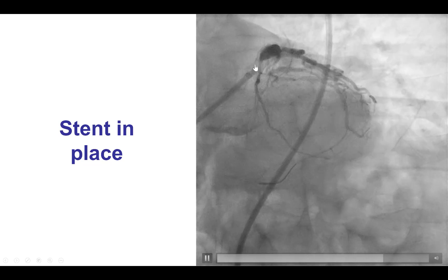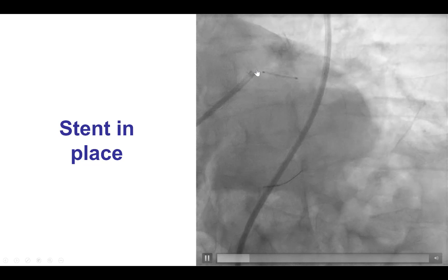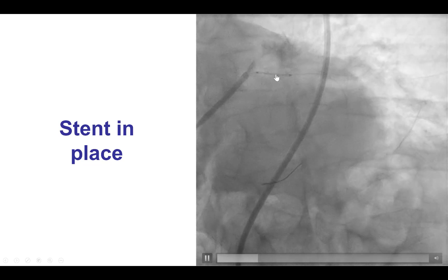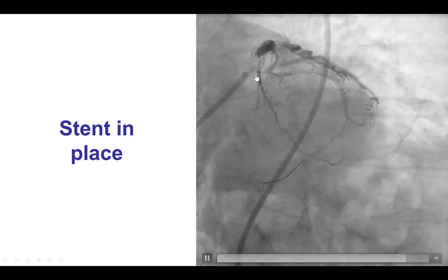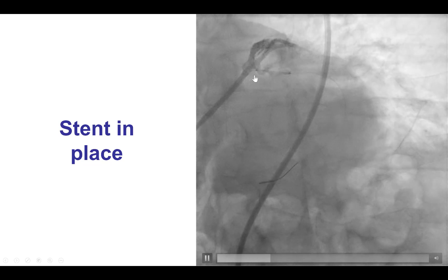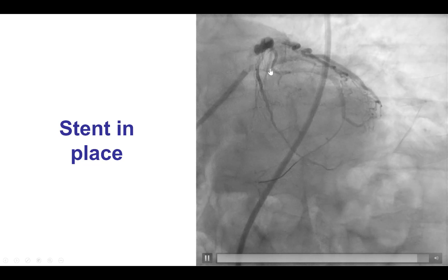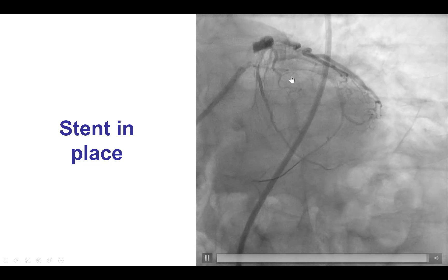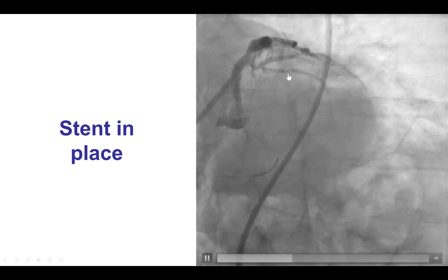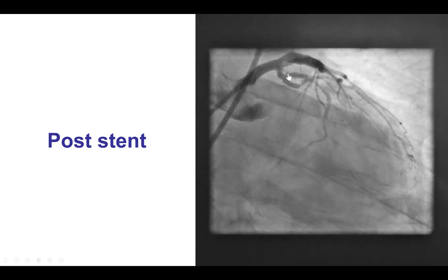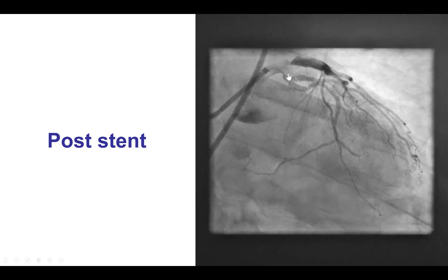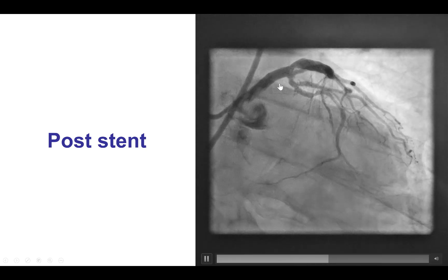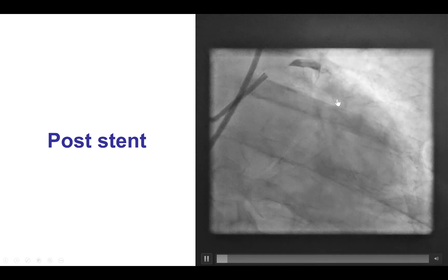There appears to be disease in the ostium of the circumflex, and in addition to the disease distally, but this is most likely a pseudo-lesion, because of straightening of the vessel from the guide wire that has gone through. So the stent was placed, and there is a good result of the bifurcation.